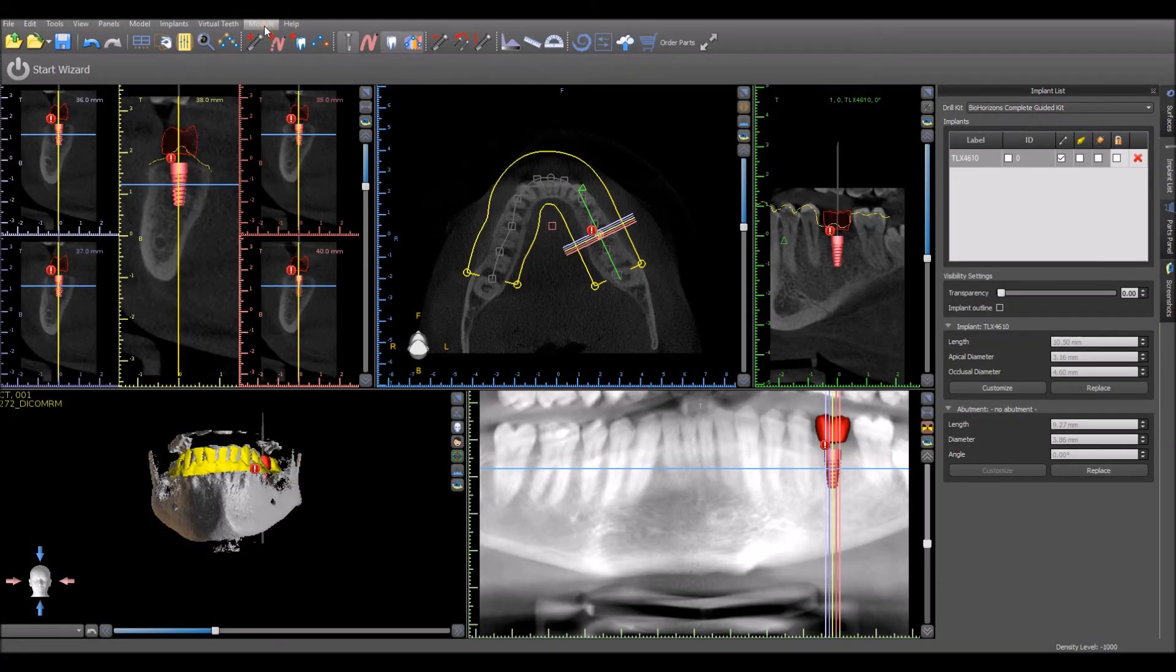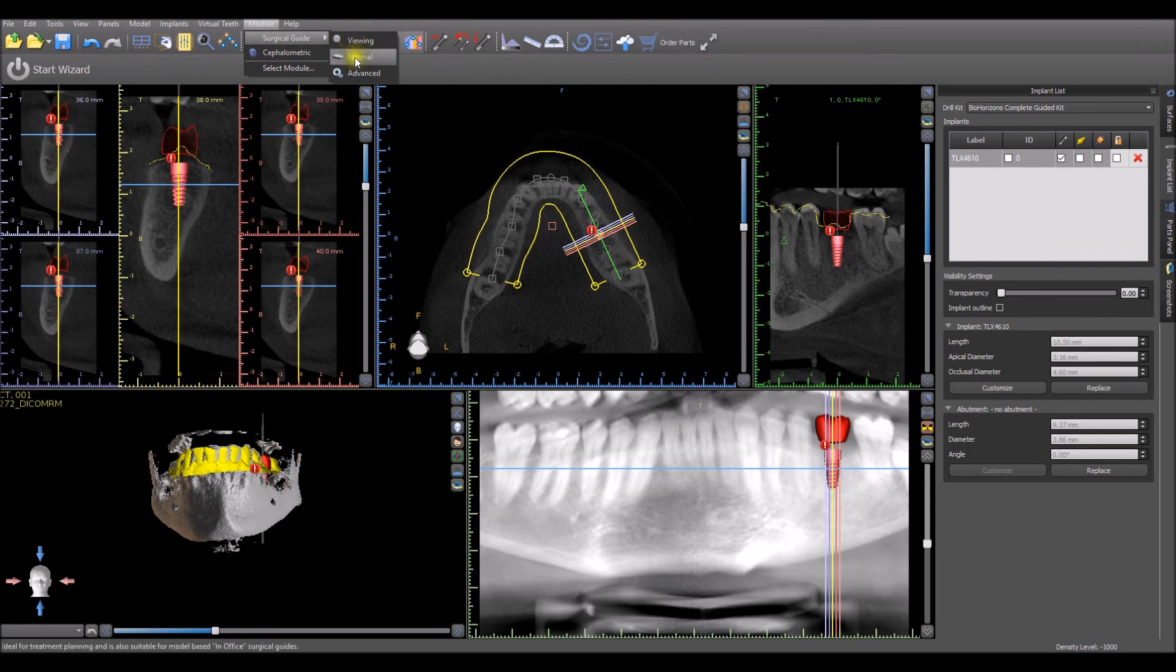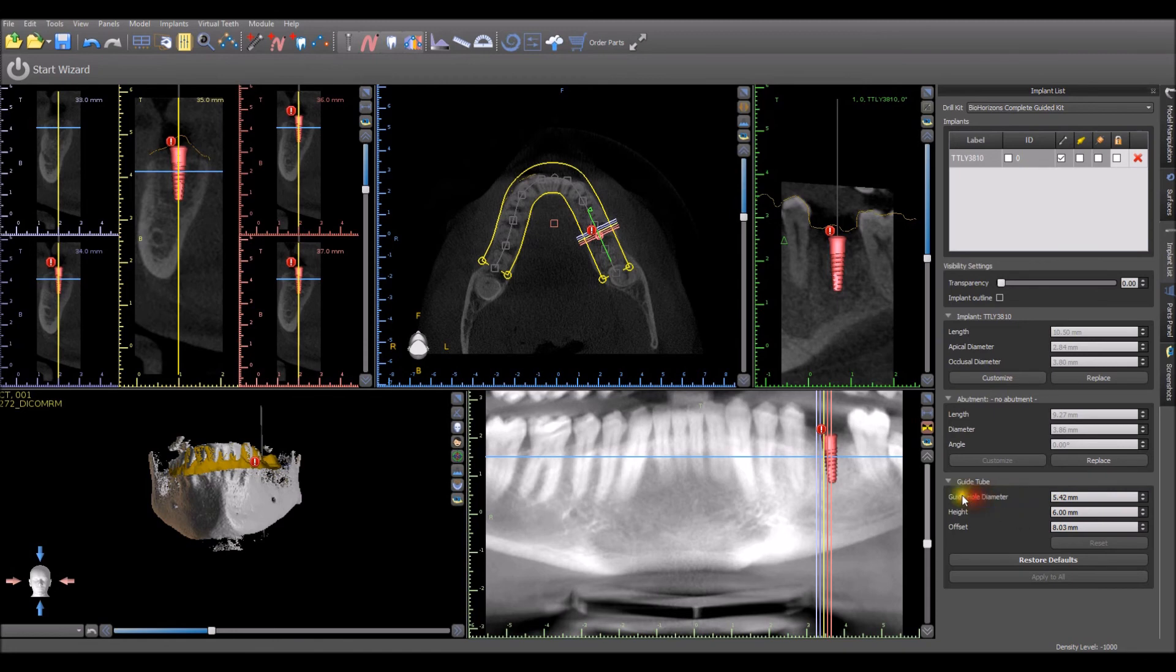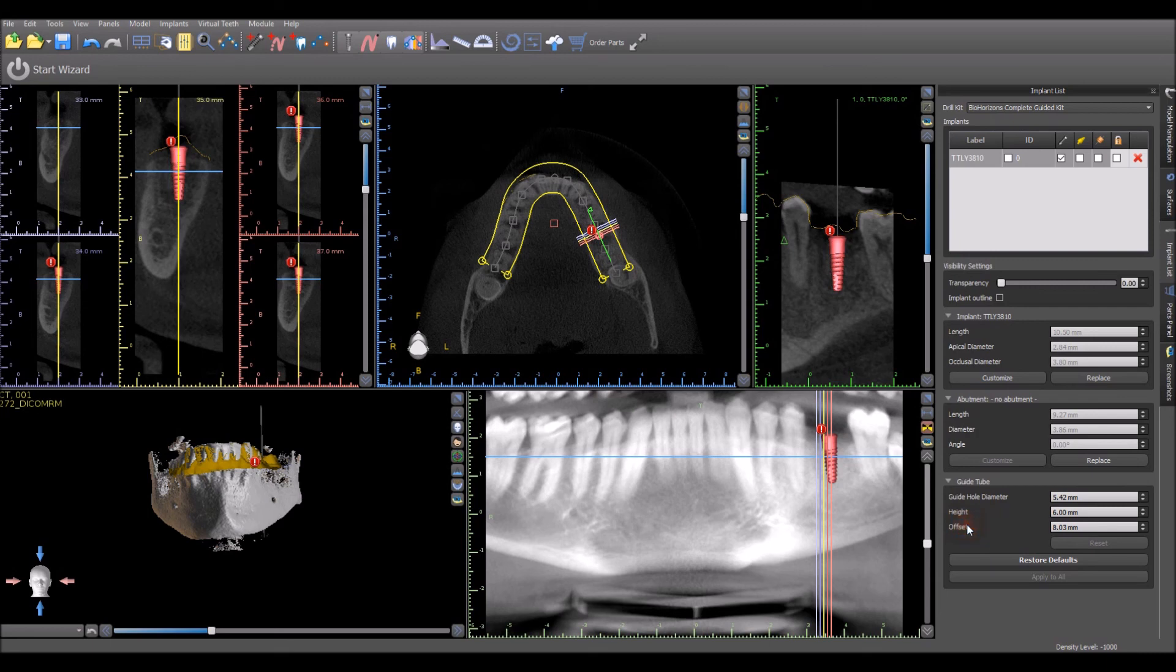Switching to advanced mode shows the guide tube settings in the implant panel for the guide hole diameter, height, and offset for the relevant guided surgical kit and implant. These settings can be edited if needed.